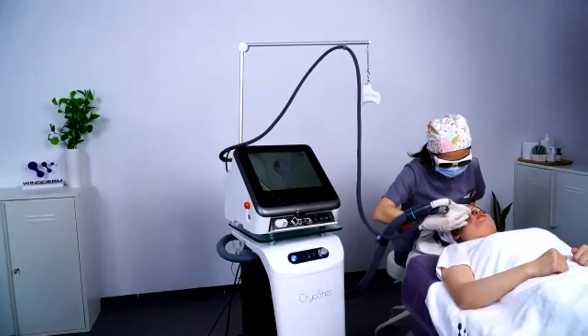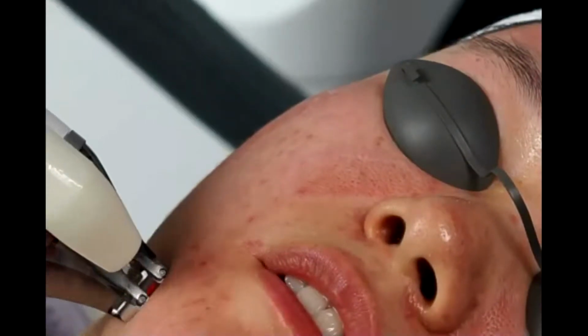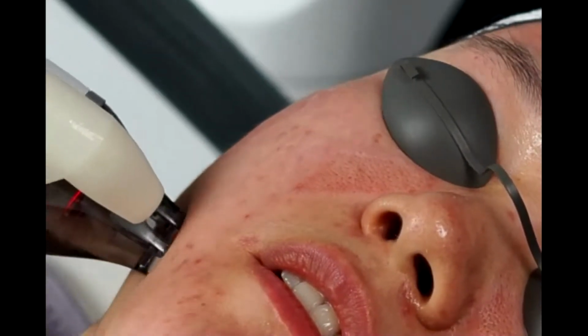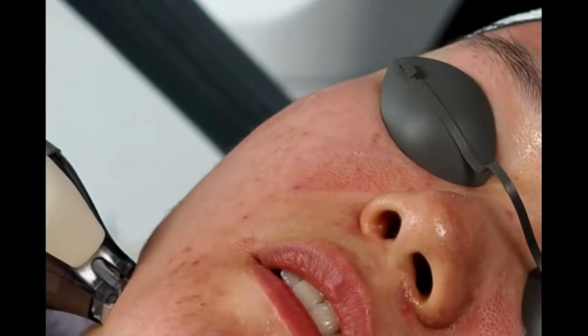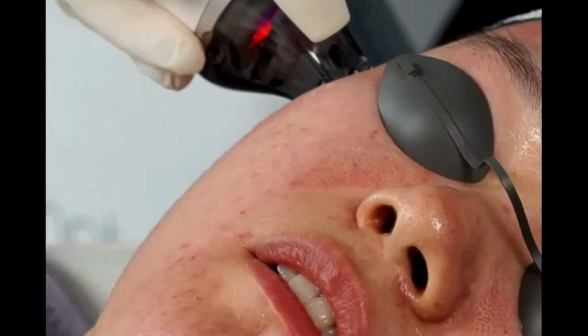We had better avoid the areas we already did, to avoid extra energy on her skin.